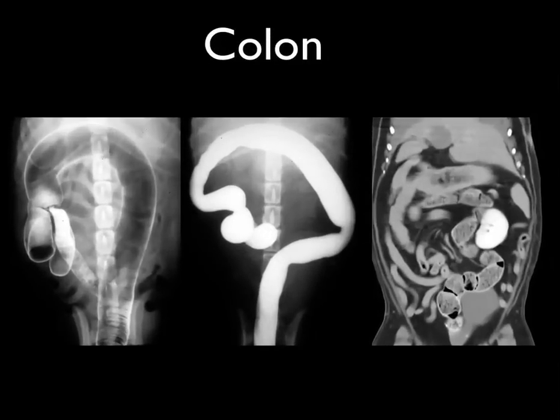Prior to scanning the colon, it is important to remember its anatomical conformation. The colon is made of 3 segments. Starting at the ileocecocolic junction, we can find the ascending colon. The transverse colon is lying caudal to the greater curvature of the stomach, and the descending colon is crossing sagittally the entire abdomen, mostly along the left side.